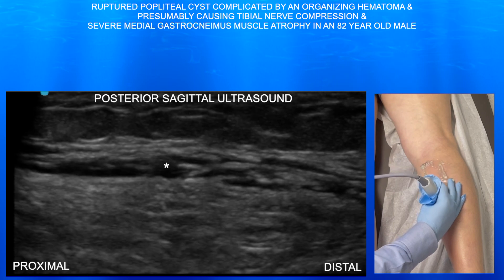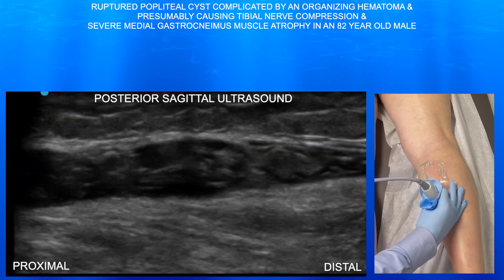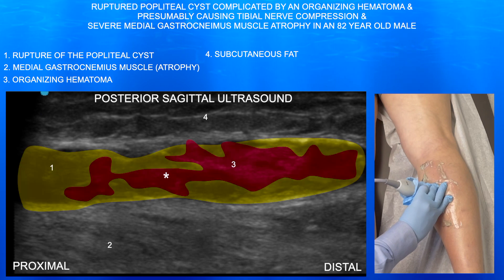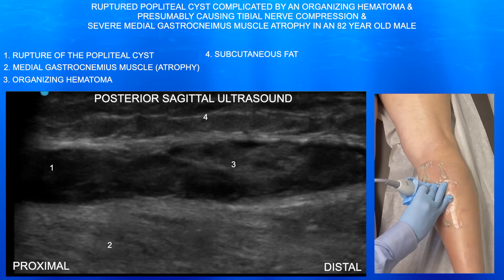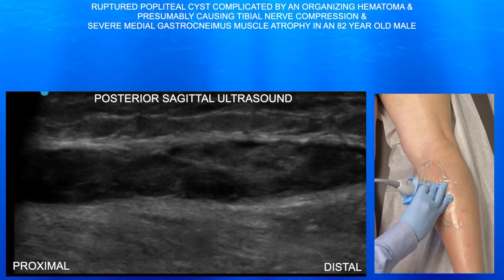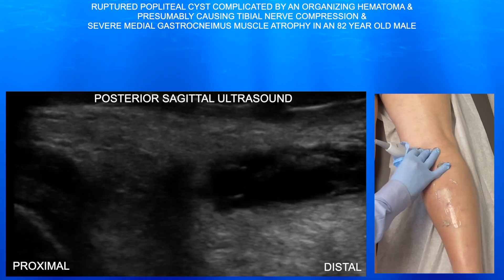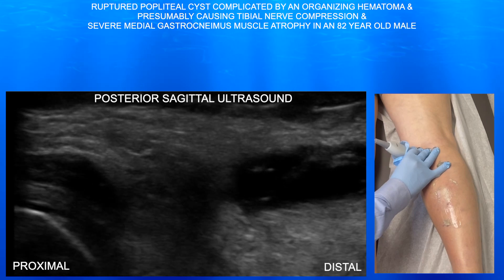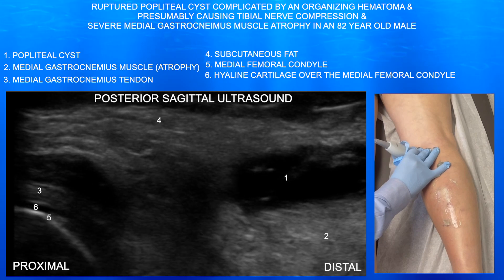Here we're going distally. You can see the fluid tracking within the subcutaneous tissue. This is a very oblong popliteal cyst, and there's hyperechoic signal and stranding within this cyst, consistent with organization. Given the fact this patient is on blood thinners, it was initially felt as maybe an organizing hematoma mixed in with this cyst.